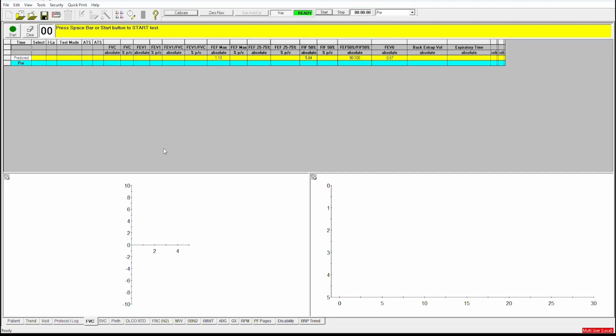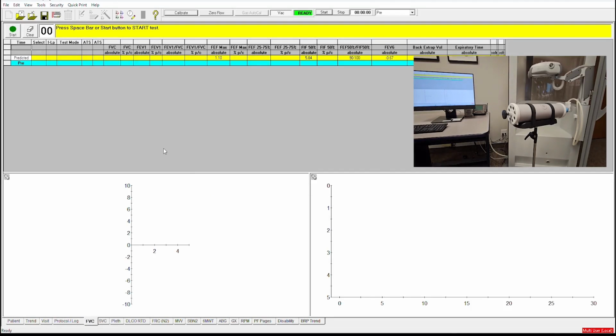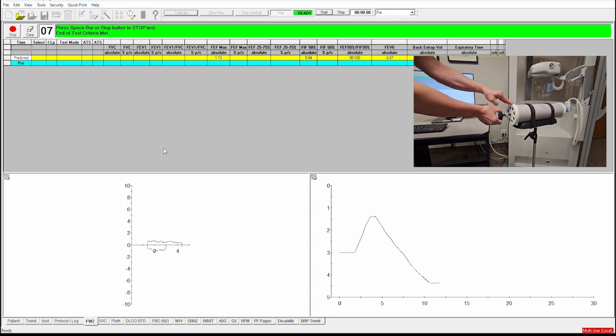Perform 5 to 7 FVC efforts, varying the speed of each effort. Perform slow, medium, and fast FVCs to cover the flow range that patients will achieve. Disregard any error messages that are displayed. Once all efforts have been performed, verify that the measured values are within specifications.